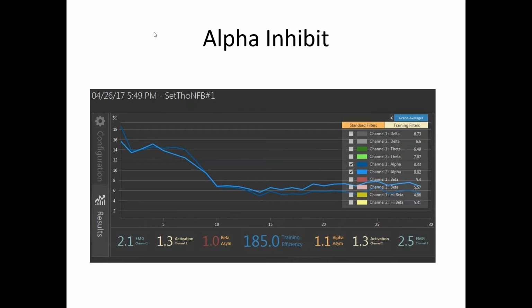But, you know, as scientists, we all argue. Thatcher would argue with me, he would say, no, you want to just constrain everything into a normative range all the time. Tom Collura would say, well, we do want to put everything into a normative range, but we don't want to constrain it all too much.